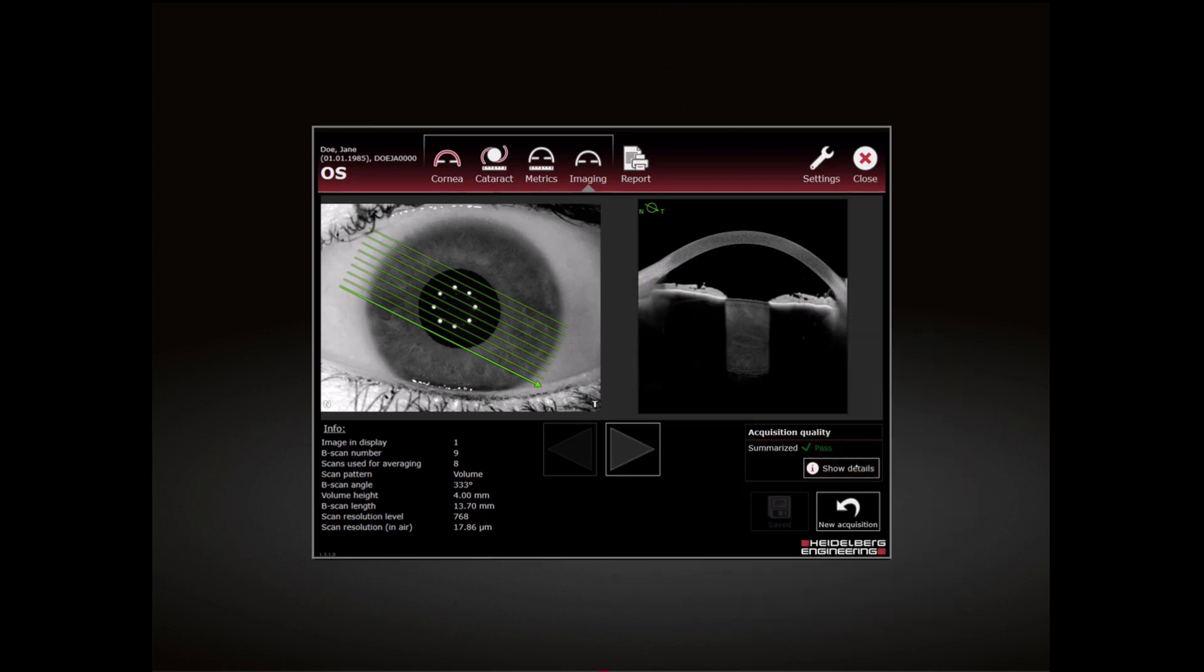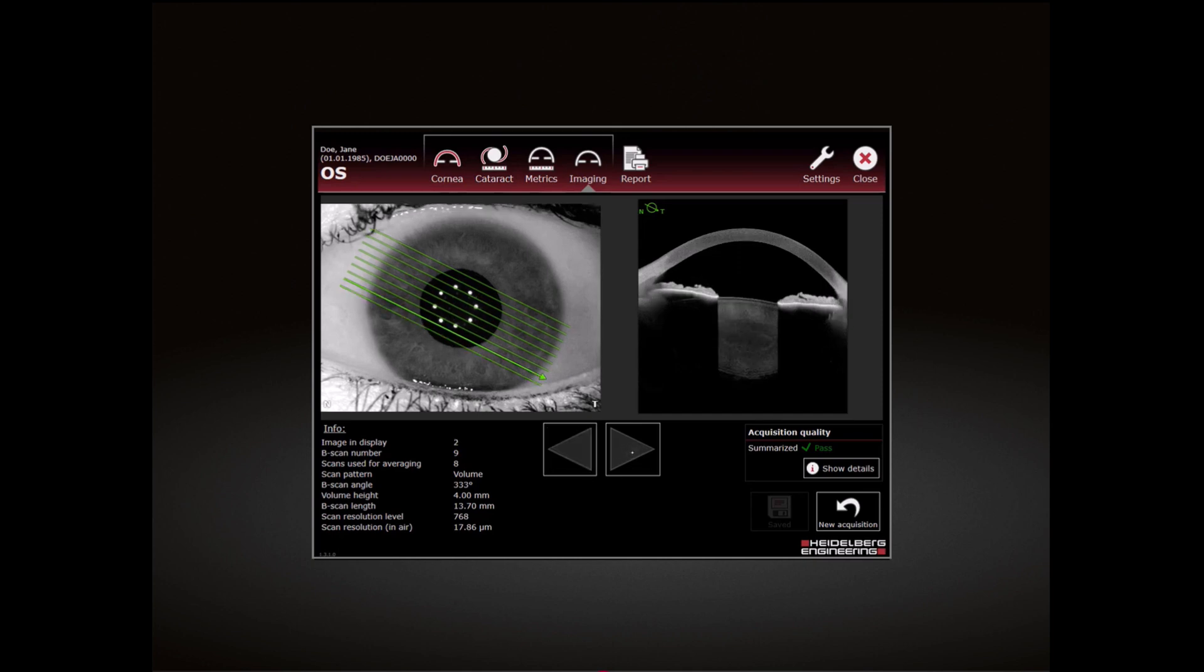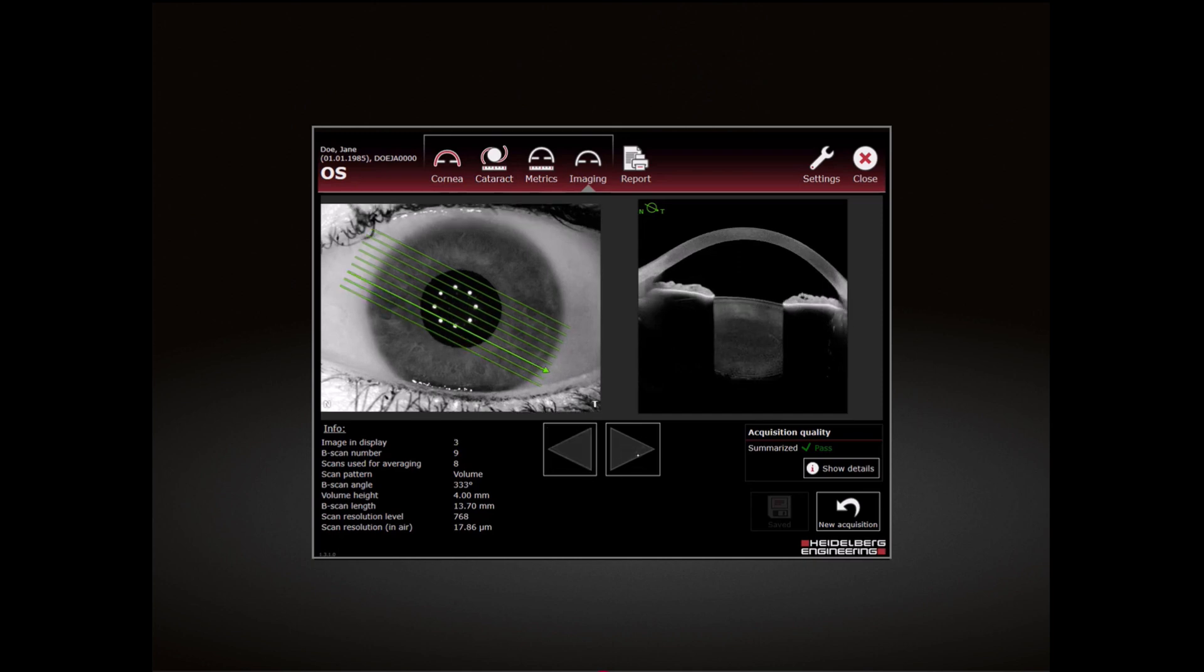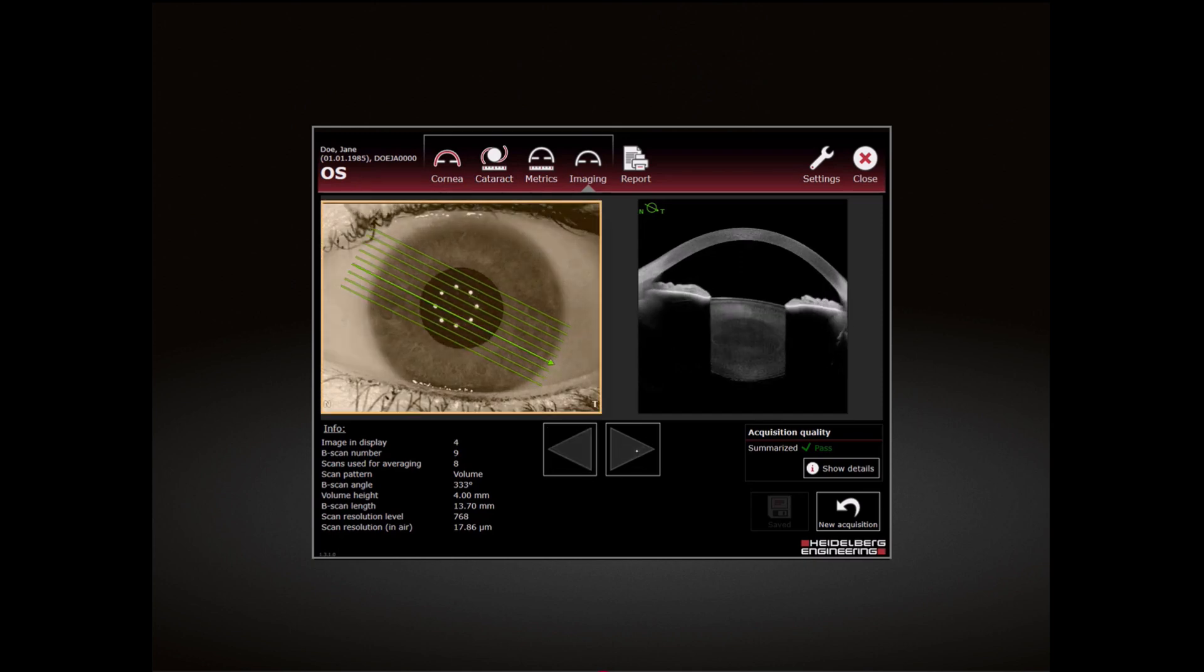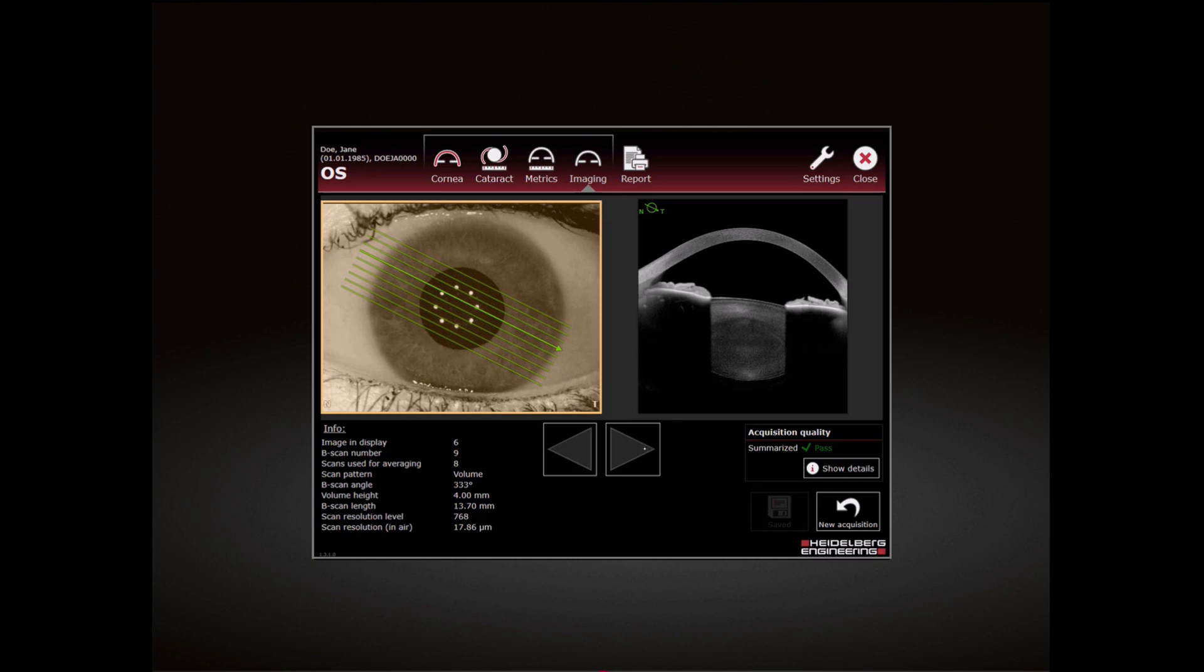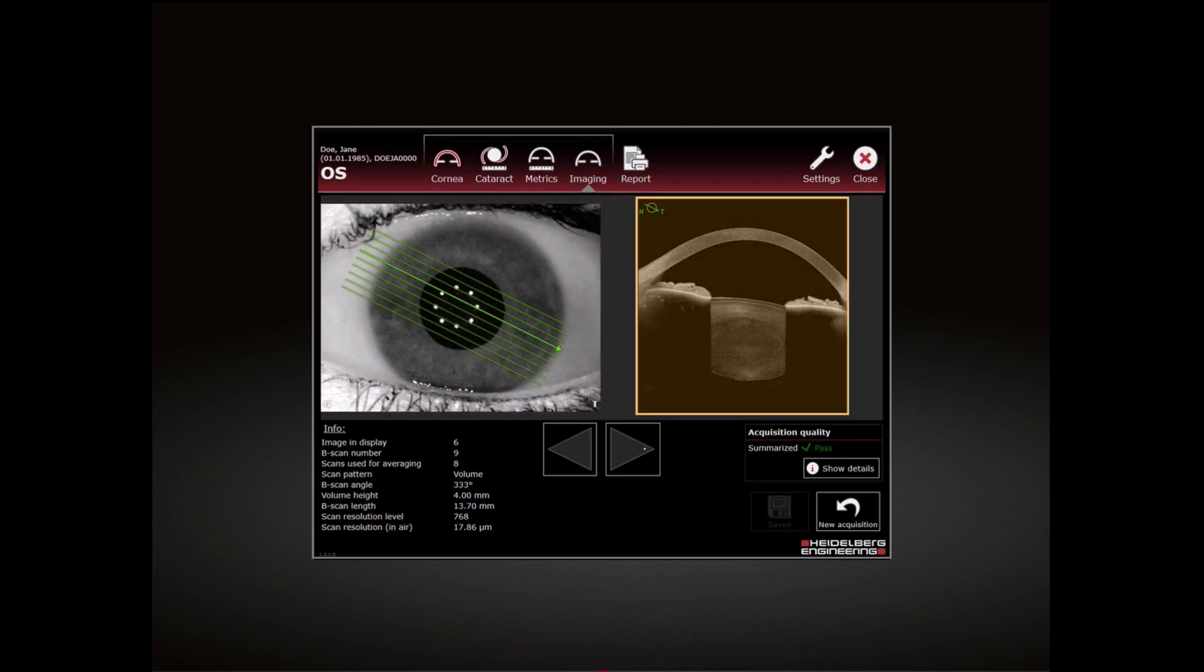To scroll through the OCT section images, tap on the Next button. The selected OCT section is highlighted in the camera image. Review the relevant anatomic structures and verify that the structures of interest are clearly visible in most of the OCT section images.